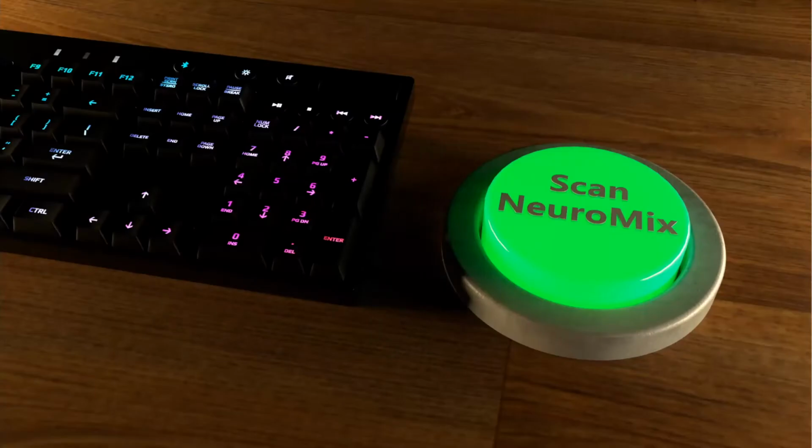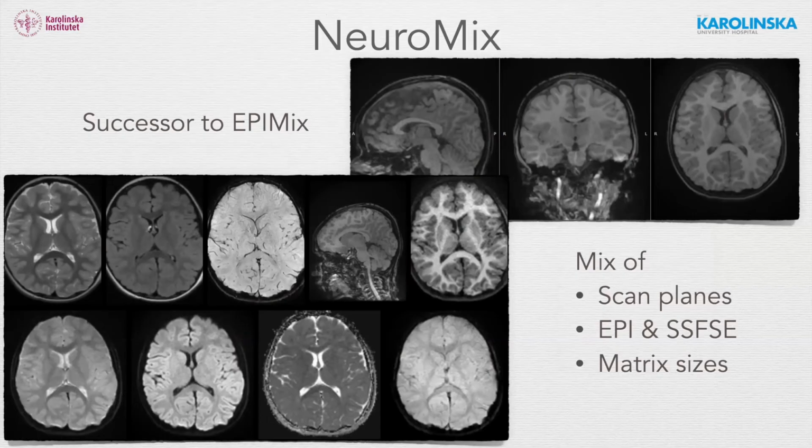So now we can come back to the mainstream for us, which is doing new sequences, new pulse sequences. Here I show the desire to have a bottom-line push-button single brain exam with NeuroMix, which is the successor to EPIMix.